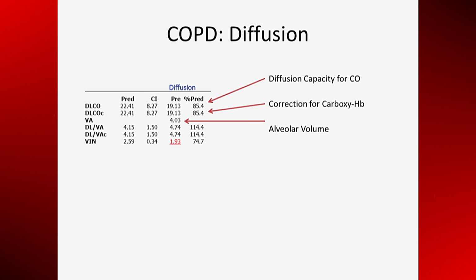The alveolar volume is determined from the lung volumes in spirometry. The correction for diffusion capacity for alveolar volume was discussed in Lecture 1. This will be reviewed in the next lecture with a patient who has a low diffusion capacity for demonstration purposes. This concludes Lecture 2. Lecture 3 will cover restrictive disease.